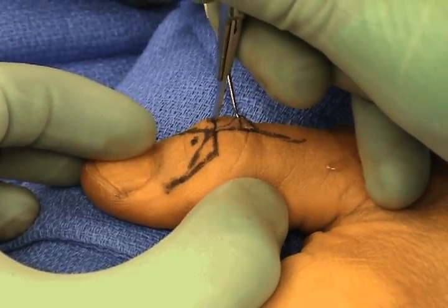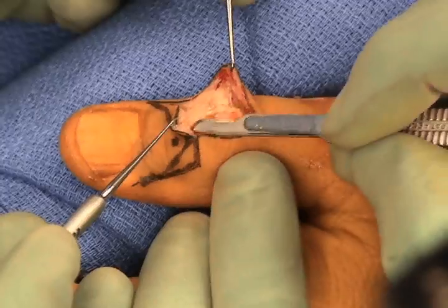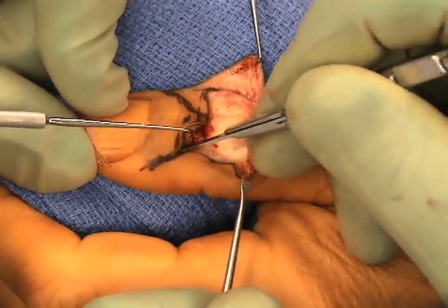Either a Y-shaped flap or a goal post flap can be used, as marked out here. In this particular case, the goal post flap provides excellent exposure of the dorsal aspect of the thumb IP joint.